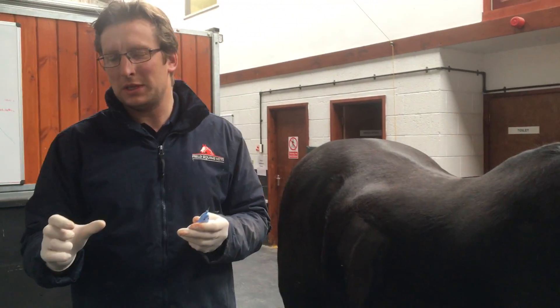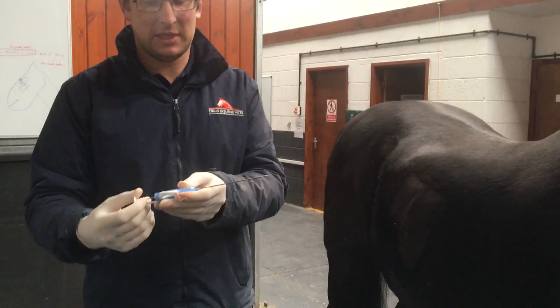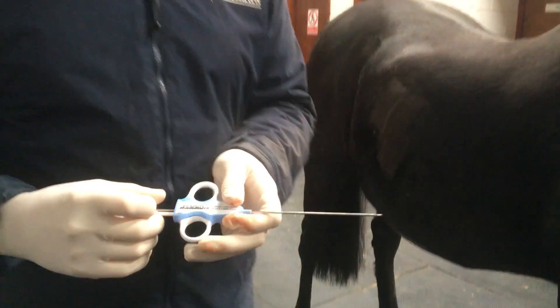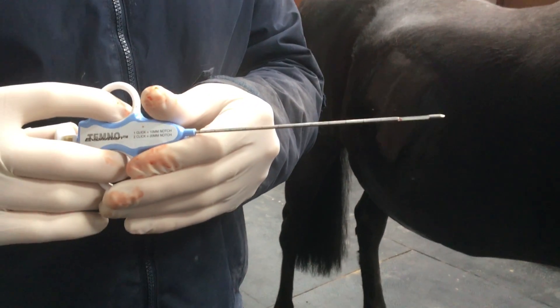From our scans, we know what depth the liver is itself, and we know how far we need to go in with the biopsy needle. This is the actual needle itself, and it's probably the biggest needle that most people have ever seen, really. But the idea behind it, basically, is that we place it gently into the liver, and then take a little sample like this.